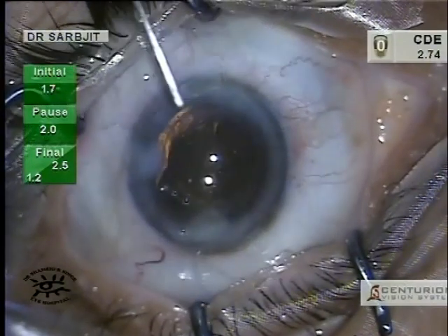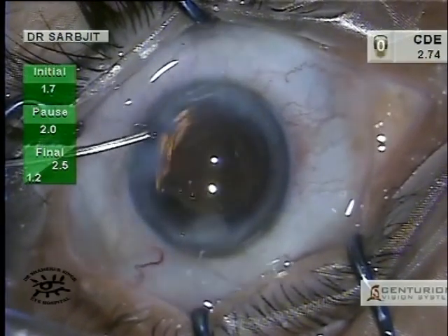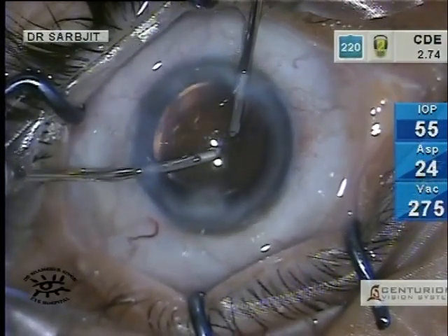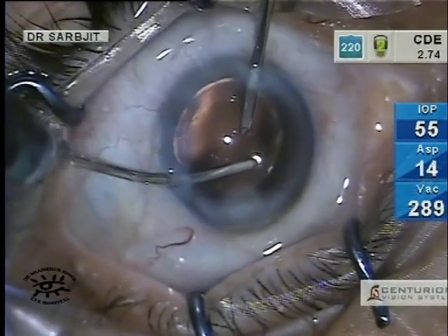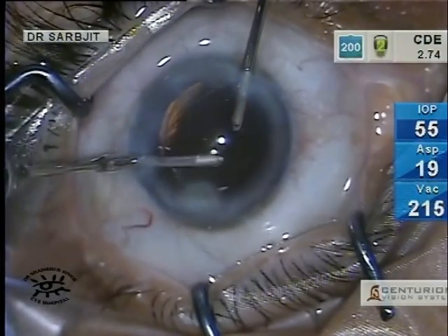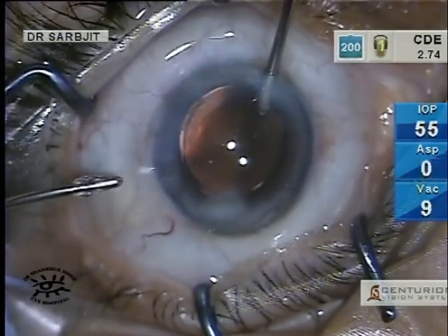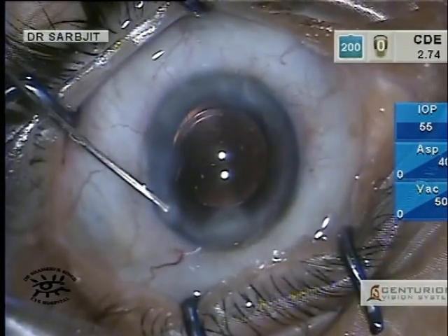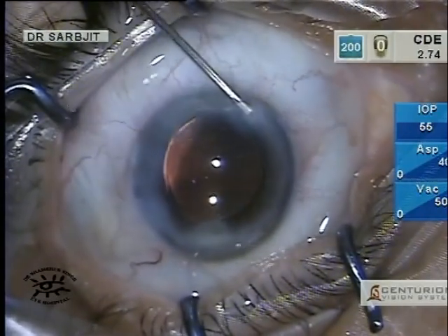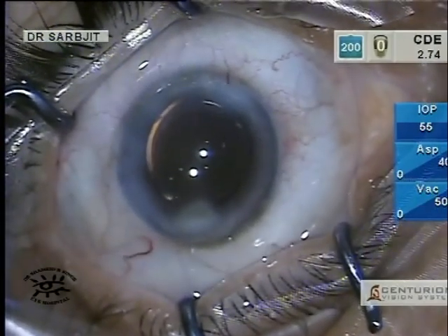I hydrate the main incision before I remove the viscoelastic, then the viscoelastic is removed. This is quite important — we must not leave behind any viscoelastic, otherwise the IOP will go up and all sorts of other problems. Once you are quite happy with the removal of viscoelastic, you can hydrate the side ports and make sure there is no leakage and the IOP is adequate.